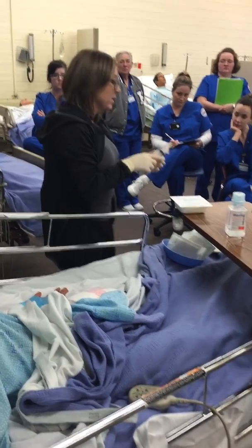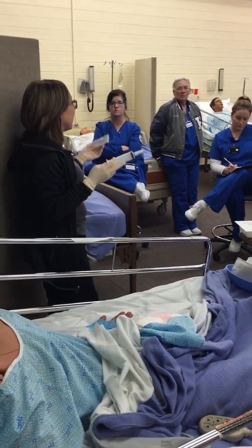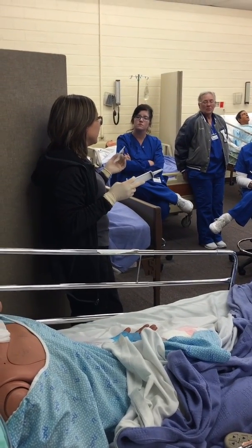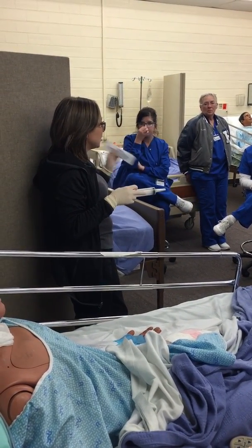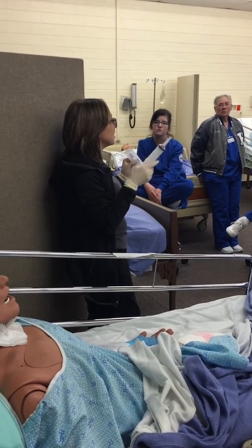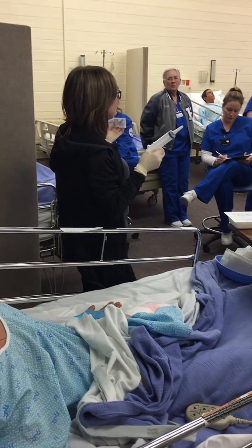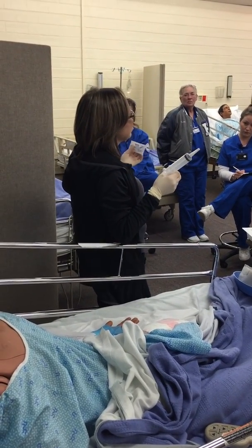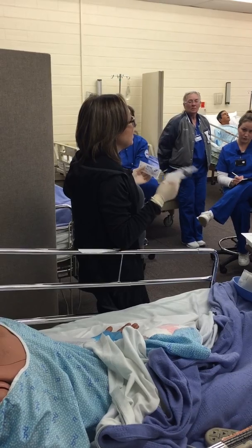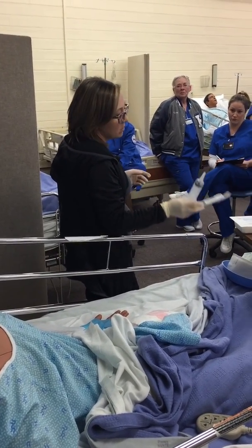All right, so really quickly, the smaller size syringe you use has a higher caliber power of irrigation, right? So it's going to be like super power to moderate power, okay? So the bigger the syringe, the less the force, basically. I like to use these because if you blast them with this stuff, sometimes it blasts in your face and on you. If you think you're going to risk anything of getting in your eyes, you need to have the splash guards on as well, okay?